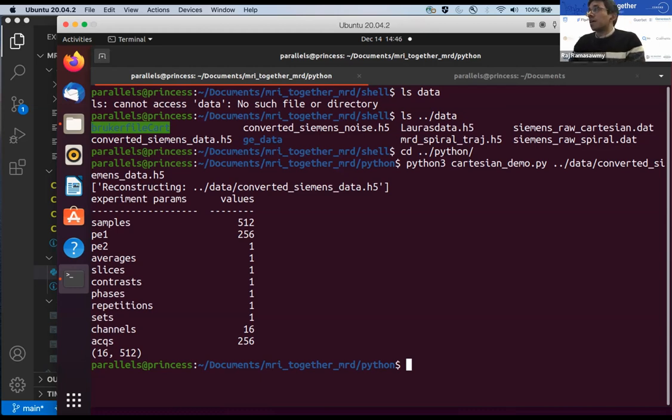That's a great question. Again, it's similar to the DICOM thing, like you will always need specific things for you. There are user parameter fields within the MRD that you can use to store a lot of abstract information, which borrows from the Siemens user WIP parameters fields. So it does have the capacity to do that. And again, it's a collaborative environment. So if there are fields you feel should be reflected within MRD, we always have scope to try and incorporate these things into it. So yes, I totally agree that there are probably some things that are missing. But the MRD format is built to be flexible to try to accommodate most things, ideally.